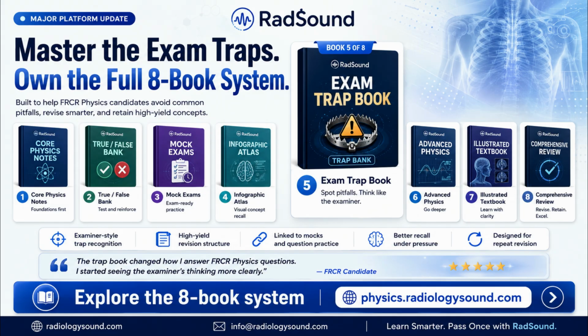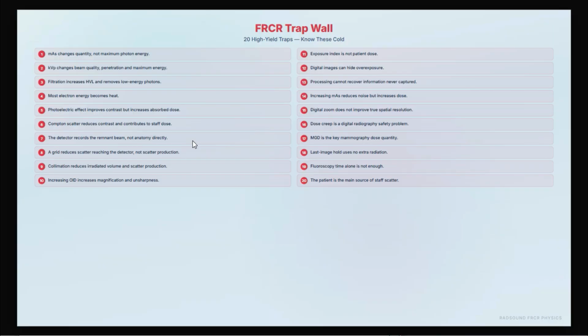Can you understand the traps? They say, for example, collimation reduces irradiated volume and scatter production. True or false? True, because it reduces irradiated volume.